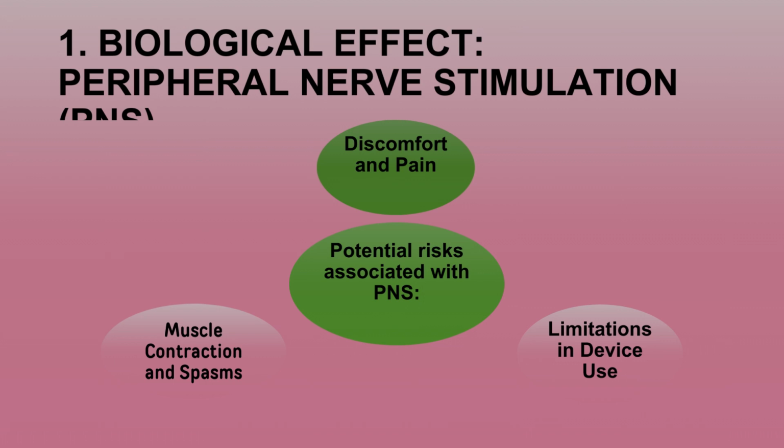Overall, understanding and mitigating these risks involve careful consideration of magnetic field parameters, appropriate safety guidelines, and continuous monitoring during the use of devices or procedures involving static or time-varying magnetic fields.